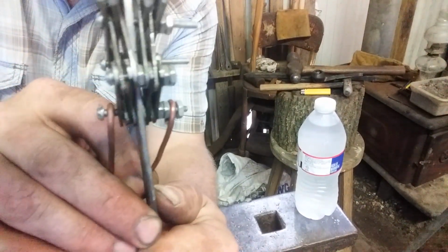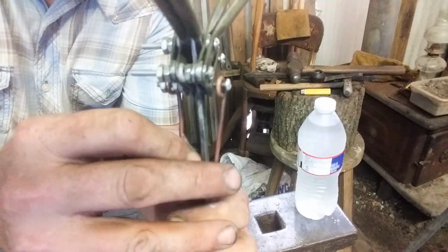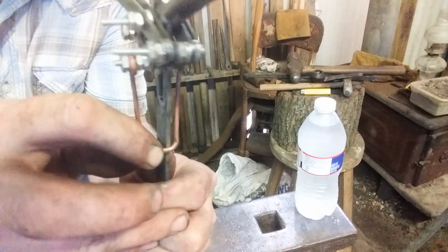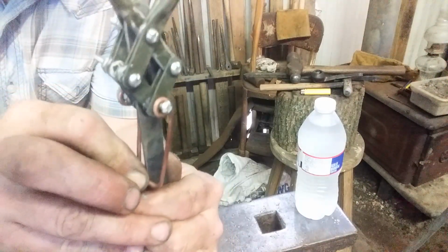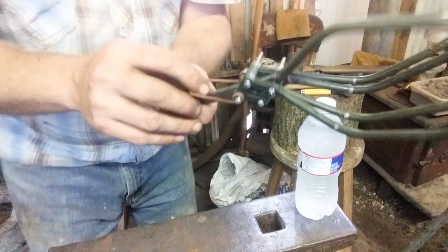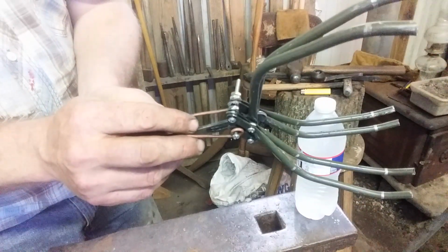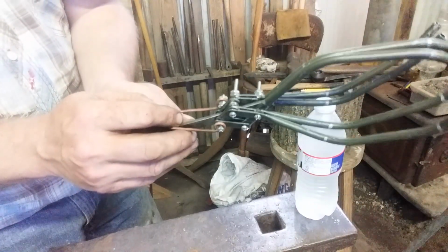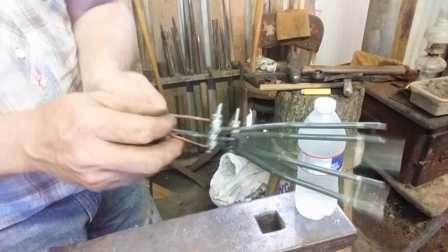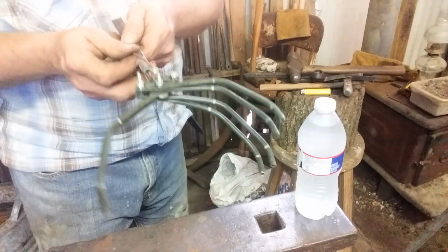I'm going to turn the whole mechanism around. You can kind of get the concept I got going on here. Of course, it will need a spring to return this. The cable can pull it, no problem, but it needs to open back by itself. Gravity ain't going to do that for you. You need a little spring action.